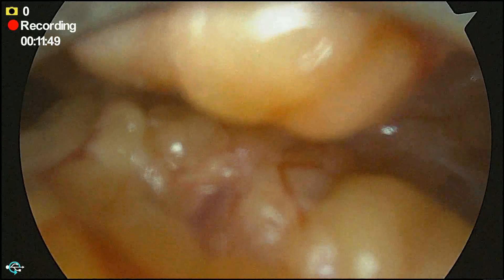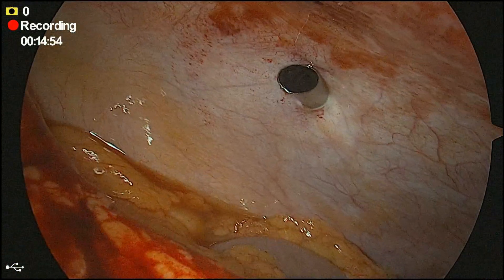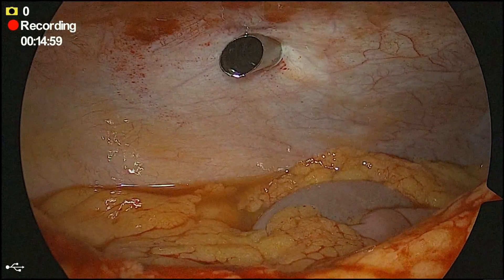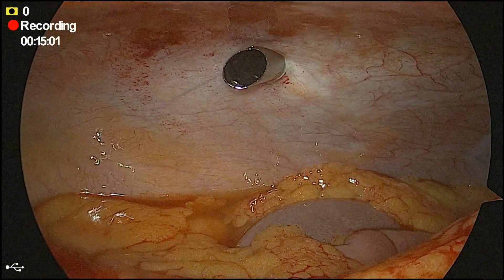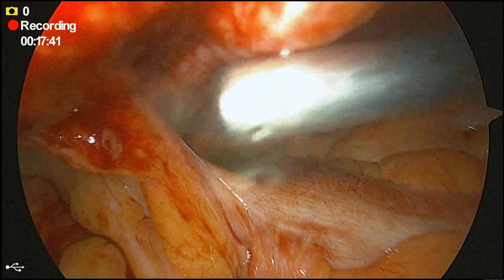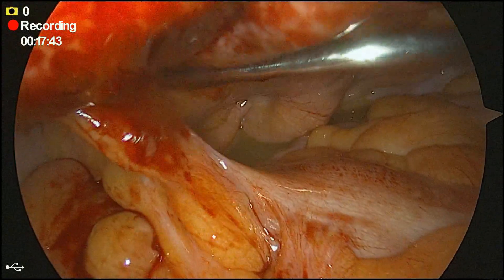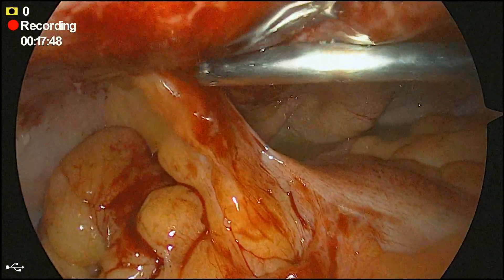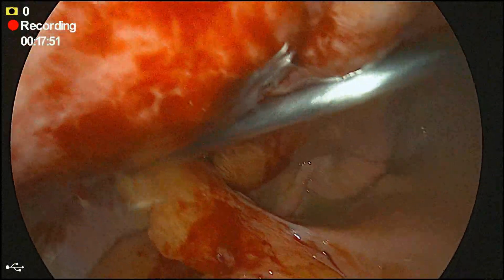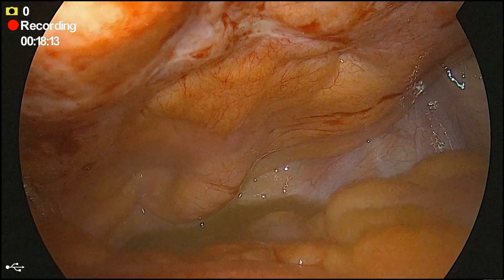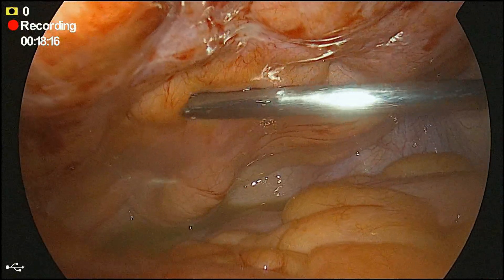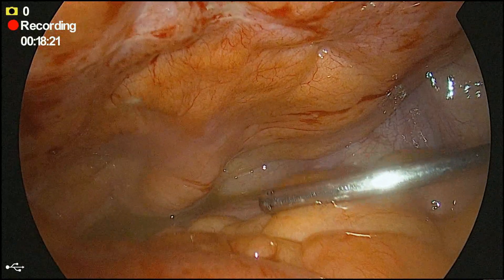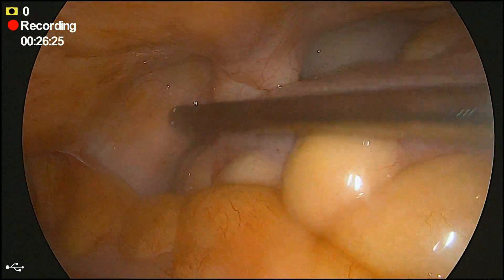This was a diabetic male with uncontrolled sugars, which was one of the risk factors for developing this infection. You can see there is purulent fluid in the pelvis. We are slowly trying to take down some of the adhesions by using the suction. This fluid was suctioned out and this is the area where the infection was present in the preperitoneal space.